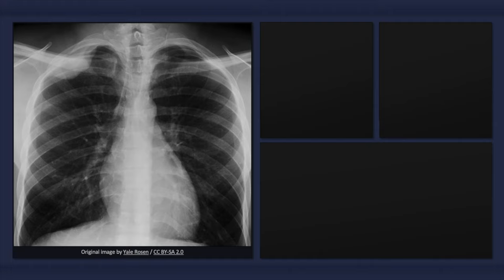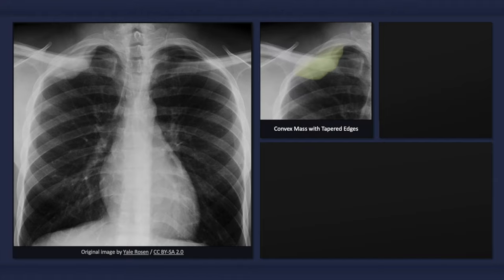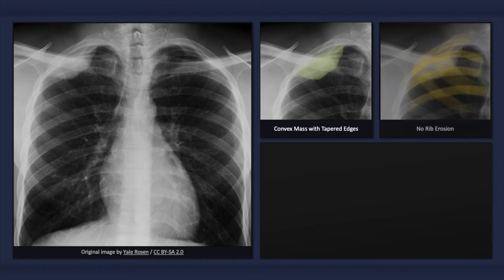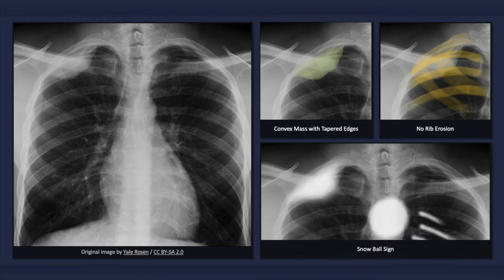The diagnosis of pleural lipoma cannot be made on the basis of a plain radiograph alone. Nonetheless, on a chest x-ray it appears as a focal homogeneous opacity with a convex bulge and a sharp border, with no evidence of bone destruction such as rib erosion. The radiographic appearance has been likened to a snowball after having made impact with a wall — note that the edges of the mass are tapered and there is an obtuse angle between the lung wall and the contour of the lesion.